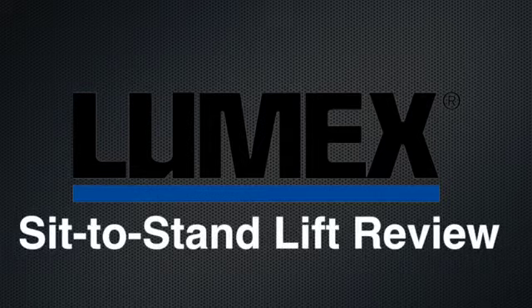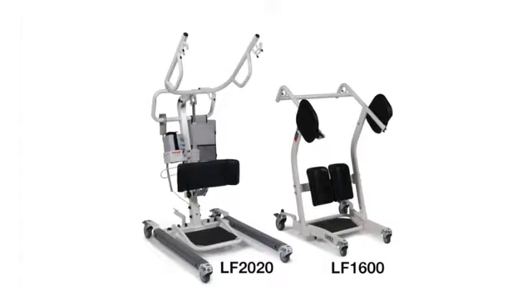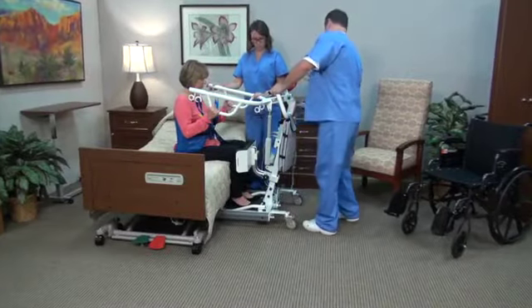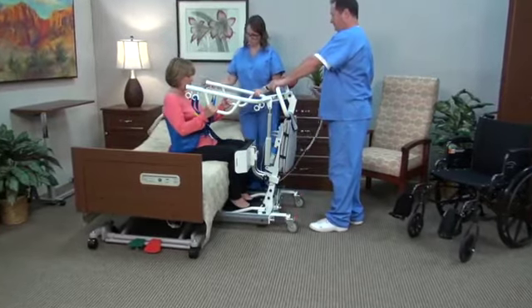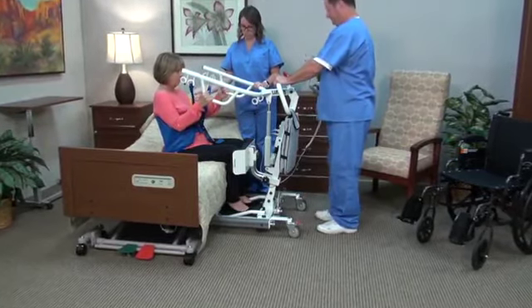LUMEX sit-to-stand lift review: LF 2020, LF 2090, and LF 1600. Sit-to-stand lifts are extremely helpful for the caregiver for pivot transfers. They are designed to provide quick safety assistance to those who have trouble standing. They are also ideal in helping to remove clothing or in dressing the resident. They are used when the resident can support approximately 60 to 70 percent of their weight and can control their upper body. Lifts enable the caregiver to safely move or transfer the resident with confidence. This video will review the LF 2020 and LF 2090 sit-to-stand battery-powered lifts.